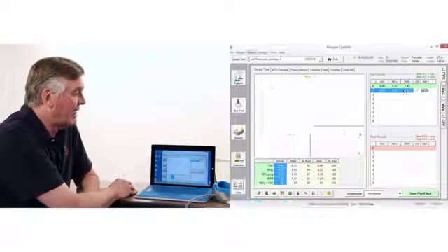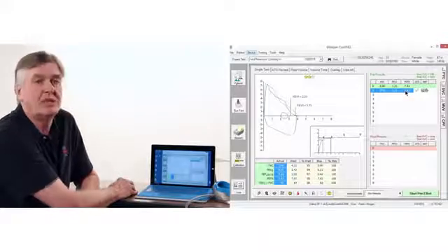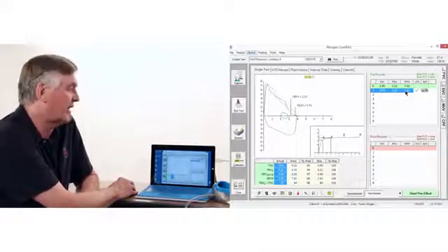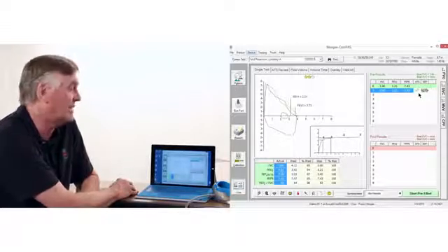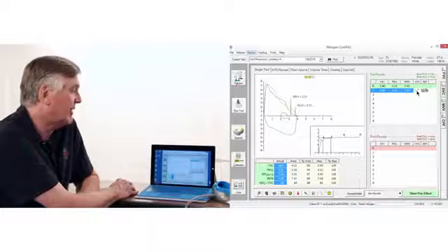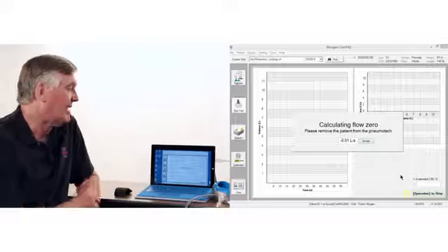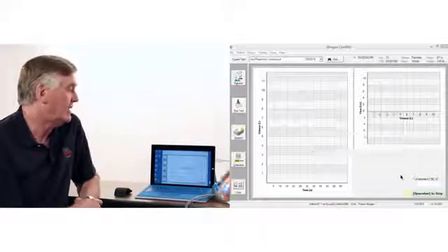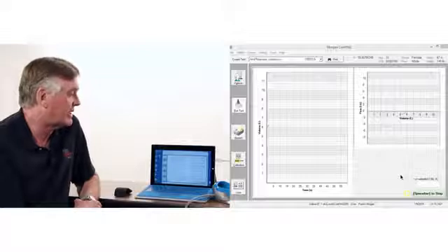Each test is evaluated for ATS criteria, which is individual effort criteria. A hollow check mark indicates that we've met all of those criteria. To move on, I can simply repeat the test. This time, you'll see on the screen a second meter that will come up once we start the test.